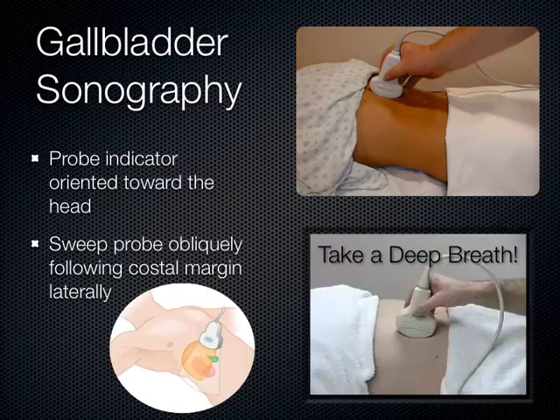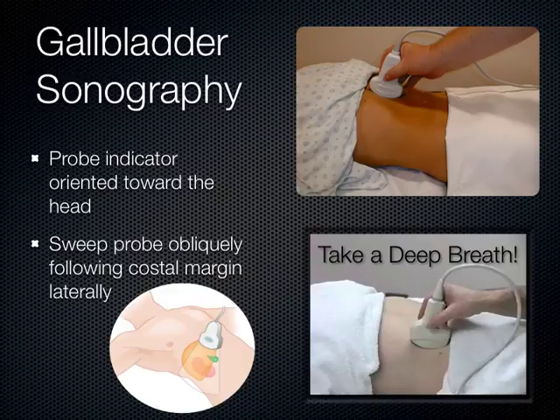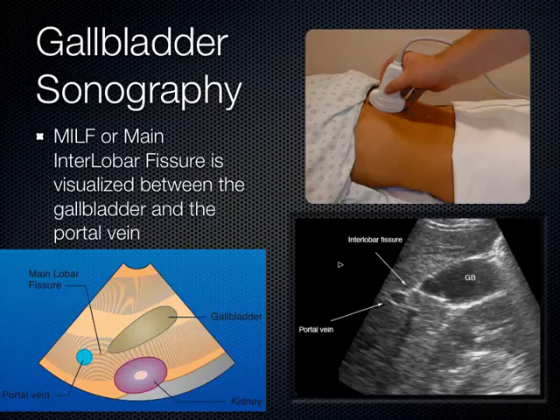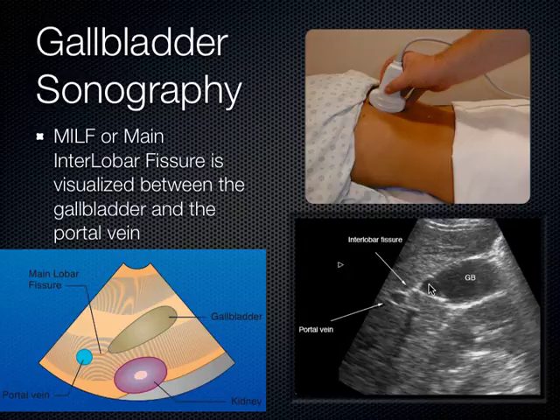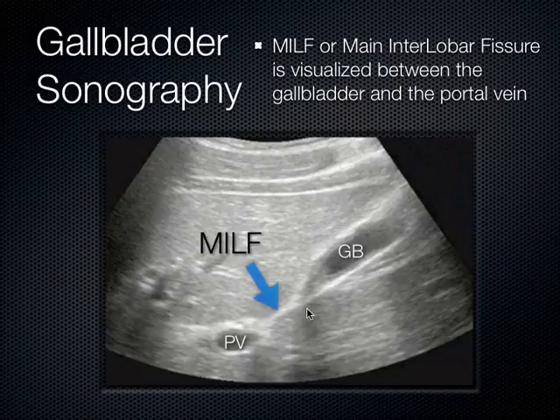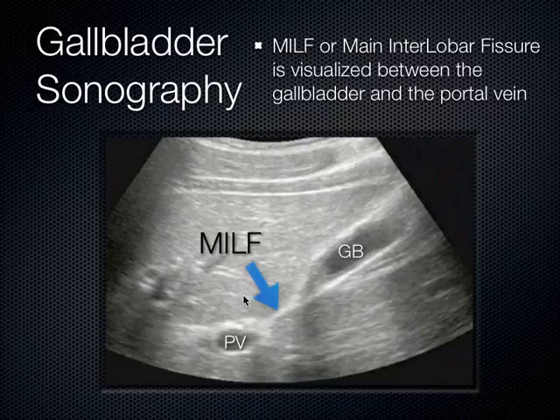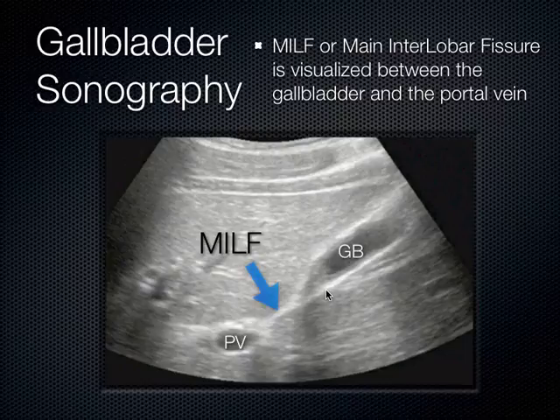Where the right and left lobes of the liver come together is called the main interlobar fissure — the fossa the gallbladder sits in. We can see the main interlobar fissure between the portal vein and the neck of the gallbladder. About 75% of patients have a very prominent main interlobar fissure connecting the portal vein up to the neck of the gallbladder. You'll see stones throughout the gallbladder — sometimes in the neck, sometimes in the fundus or body — depending on how the patient has been positioned, because gallstones roll around.